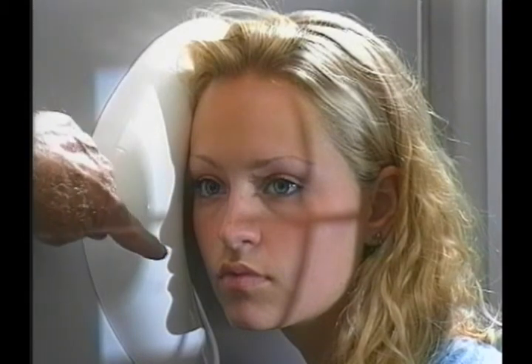For a cephalometry, it is possible to see both the soft tissues and the bones by aligning the thickest part of the filter with facial landmarks N, A, and B.